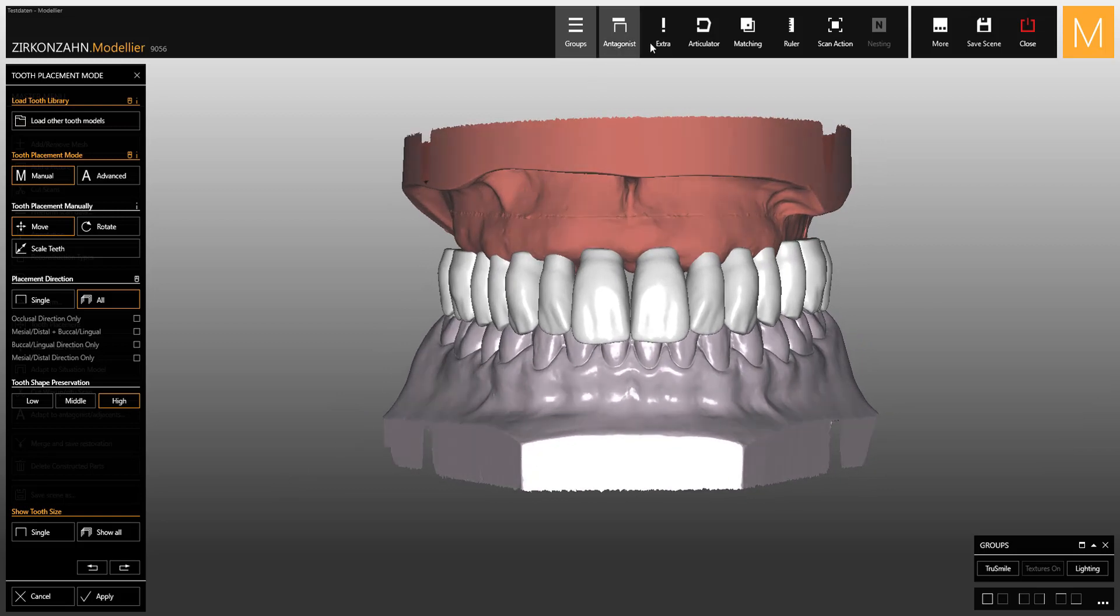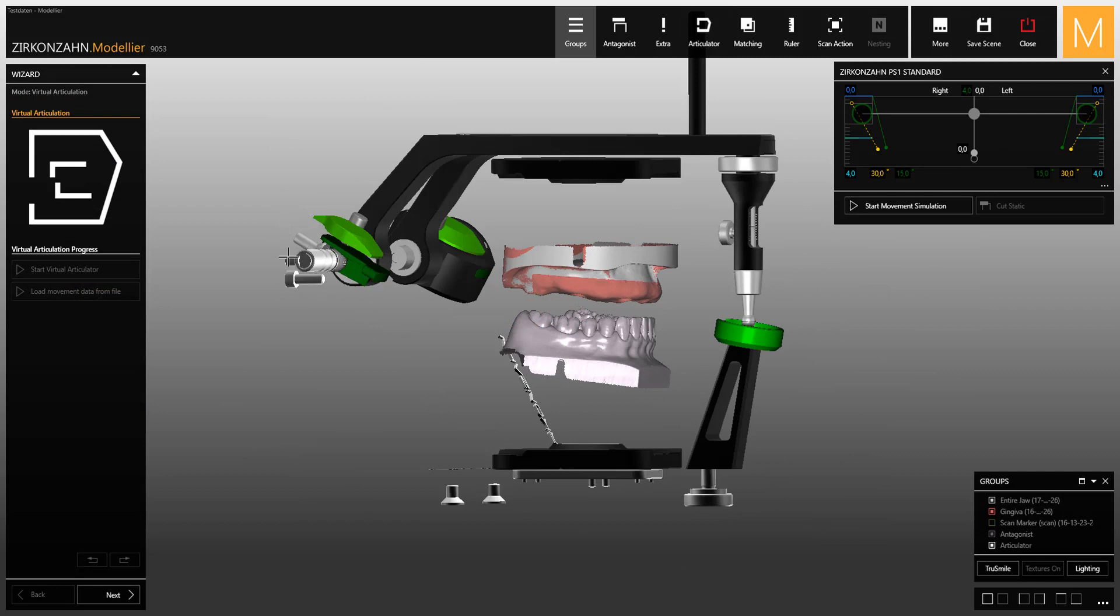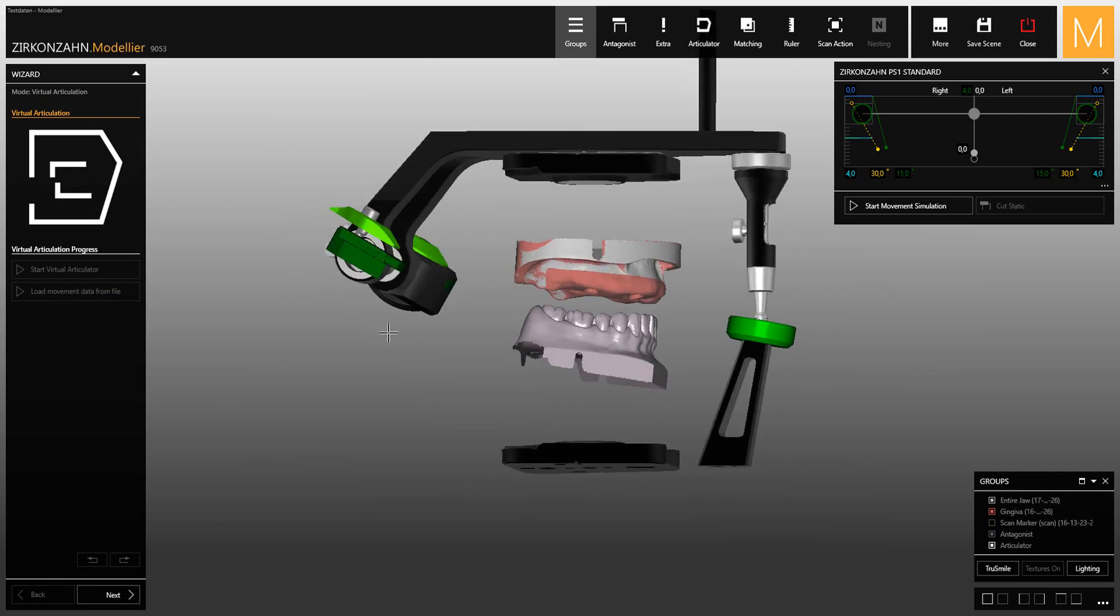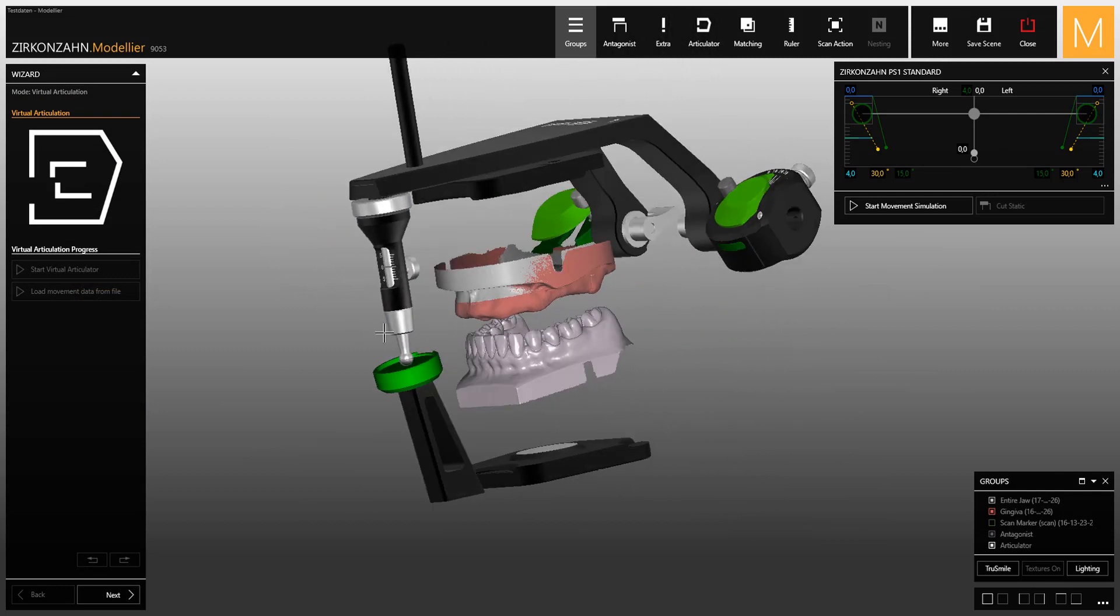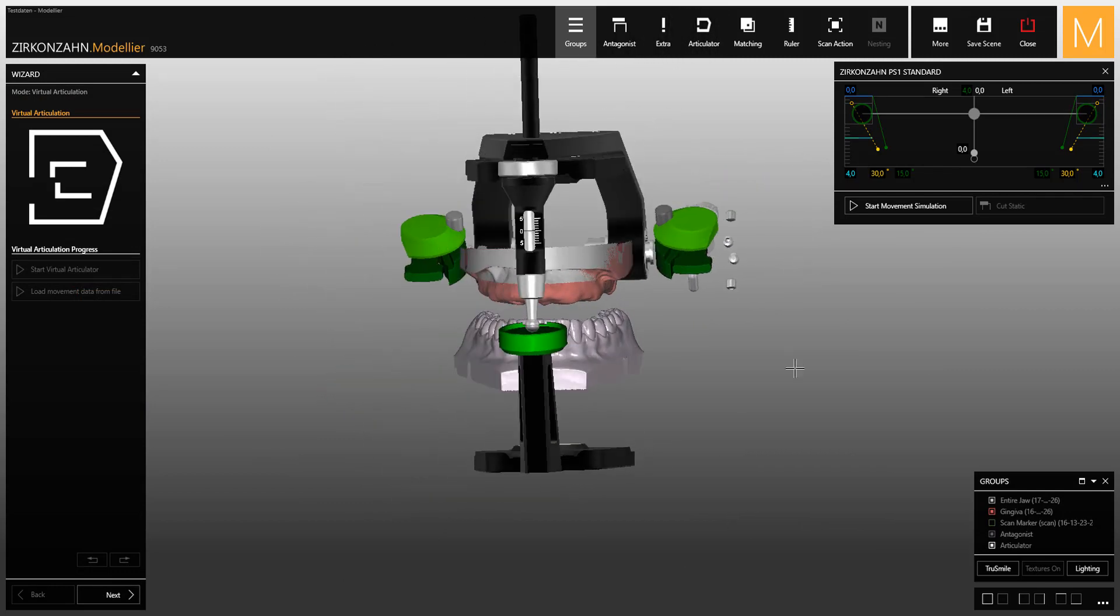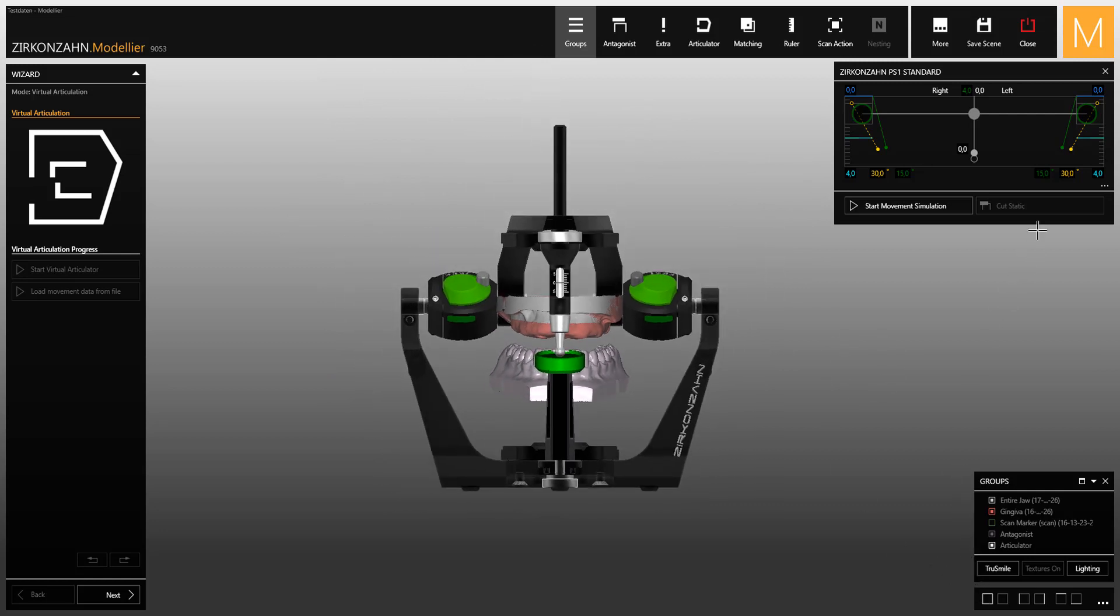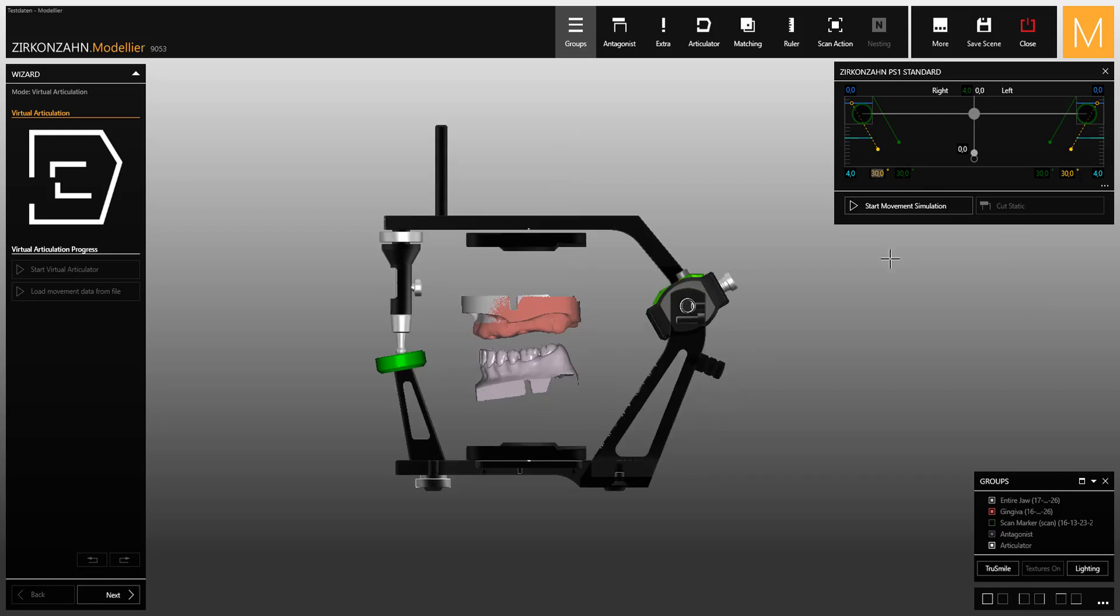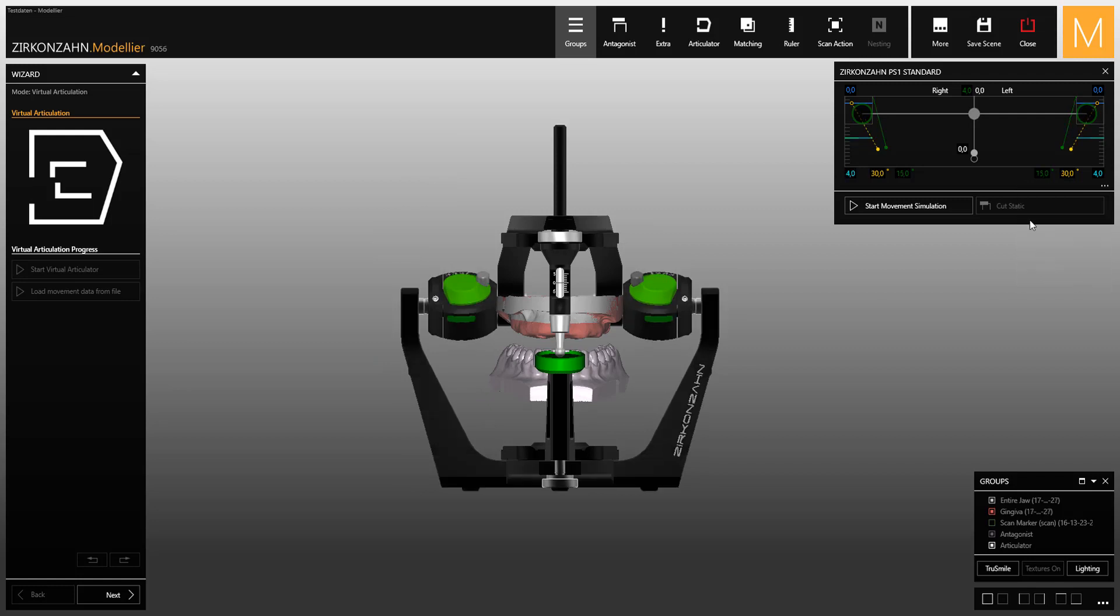By clicking on articulator on the top toolbar, settings can be changed and seen in the articulator in real time. If you wish to reset the original parameters, just select reset to default or double click on the value to reset.